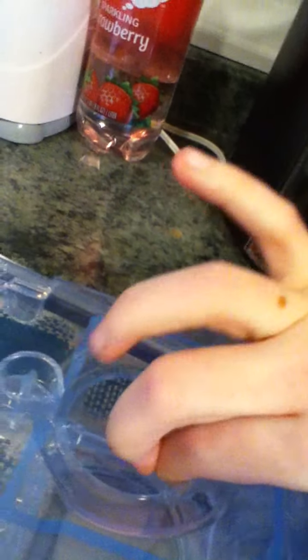It holds about 75% water. There's a little tab right there to open the top with. I'm going to put it in the top with the water using the water chamber.